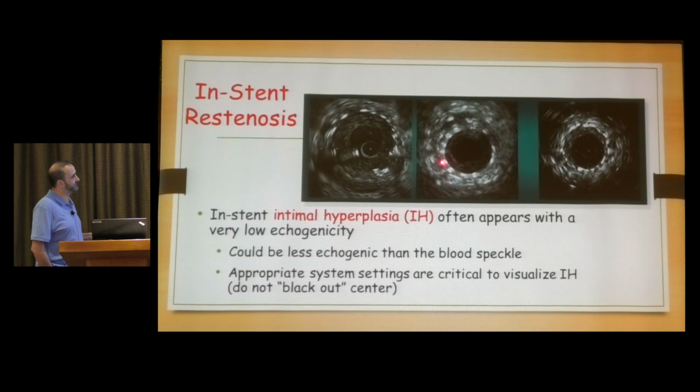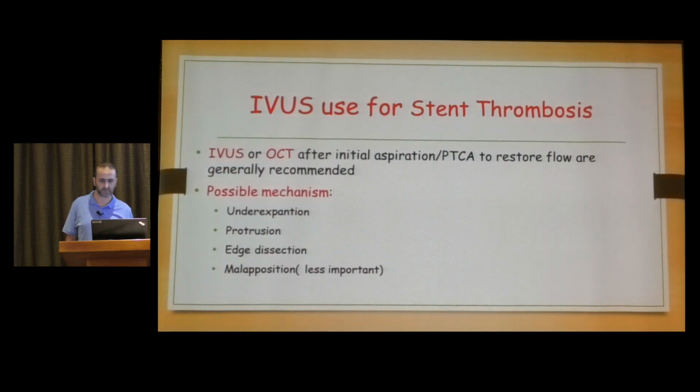This one here, we can see the two layers of stenting in this vessel, in this area here. And there's a small intimal hyperplasia here. There's much less intimal hyperplasia here. So it can give us the story about the in-stent stenosis and how much intimal hyperplasia. I have more slides at the end to show the same thing.